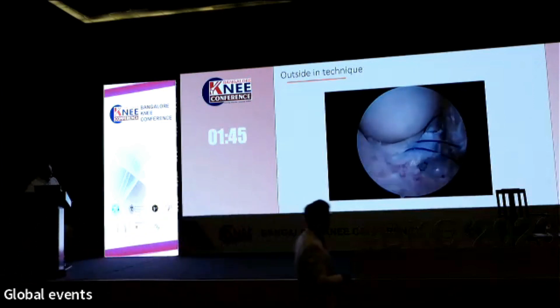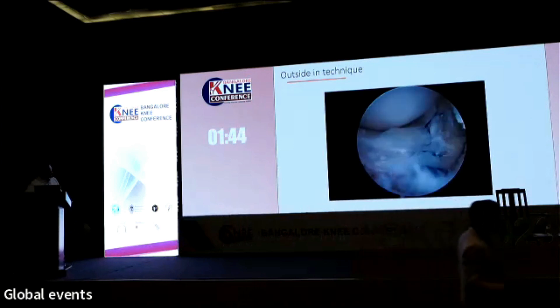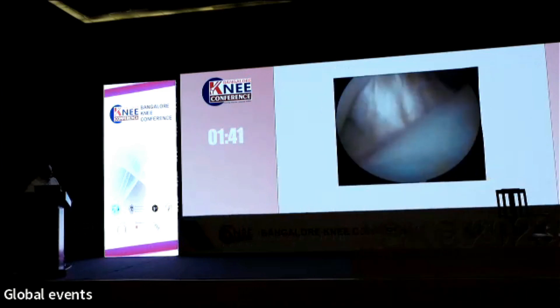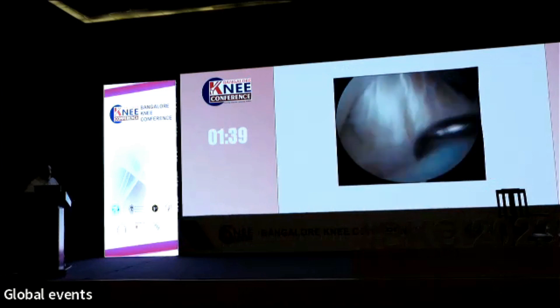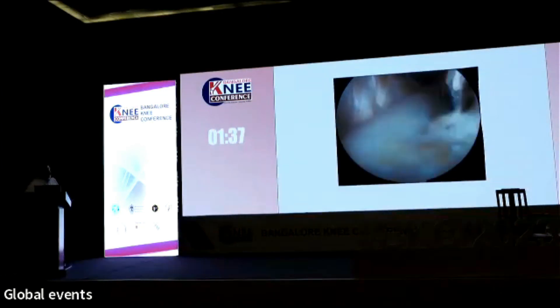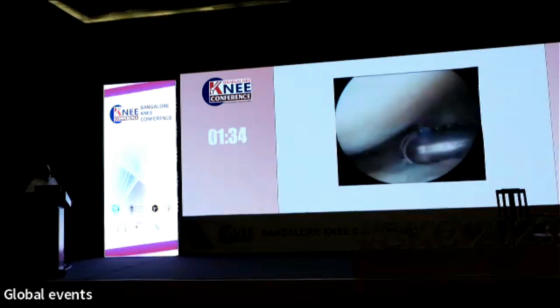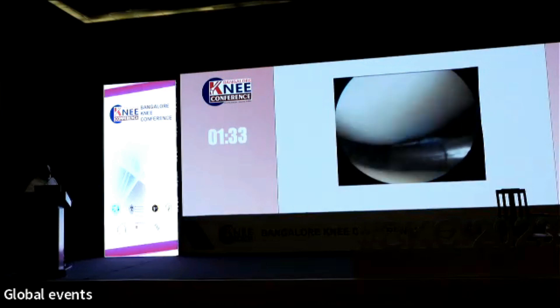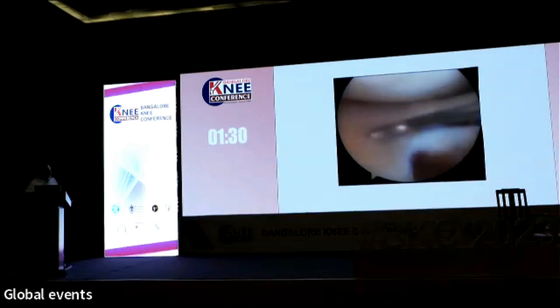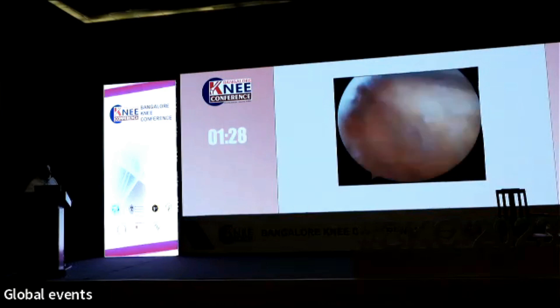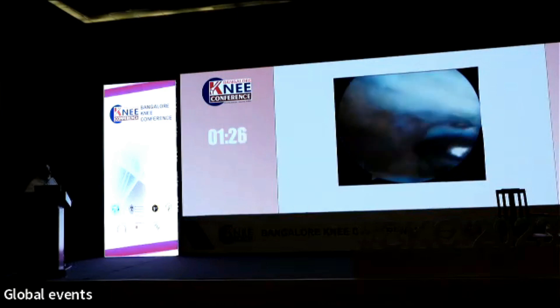You can have two or three stitches based on the tear pattern or the size of the tear. You also have something called the meniscal mender device, which is used for anterior horns. The cyst is identified and decompressed — you can see a large void in the capsular tissue along with the anterior horn, which needs to be approximated. So you debride that area.